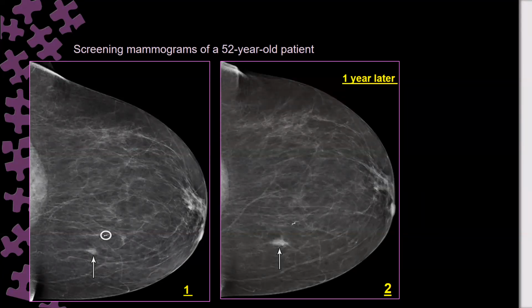It means the result tends to be benign. Otherwise, if the result was malignant, she is not going for routine surveillance, for routine screening mammogram. You know that, yeah?